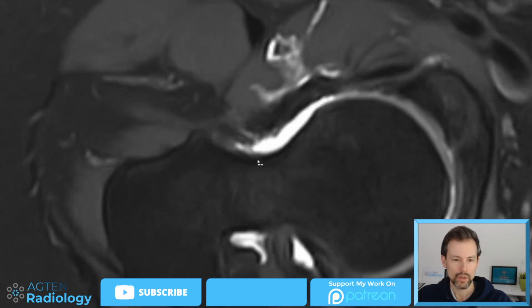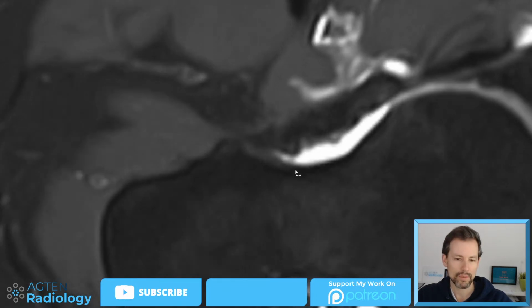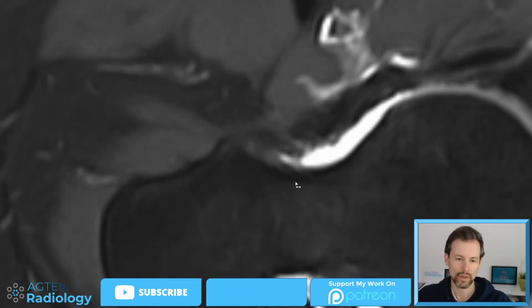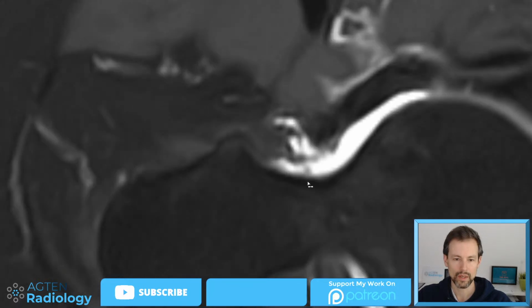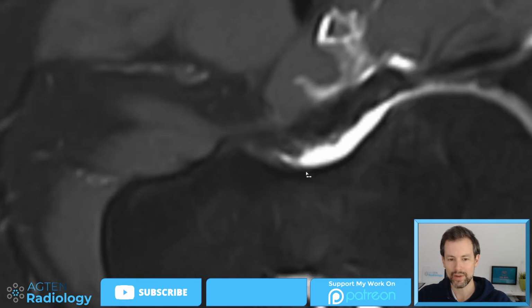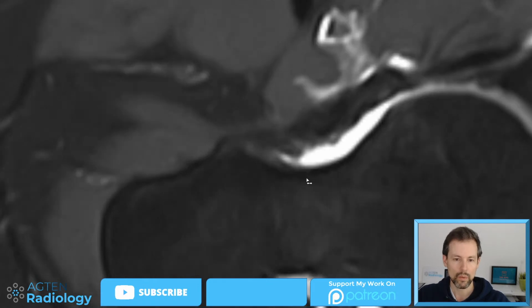Yeah, anyways. So if you look closely, you can see there are some very small adhesions there. So this one, for example. And sail-shaped, it's quite a descriptive term, so I think we cannot really appreciate this from the MR images alone, but it's not a complete adhesion because we still have contrast here. So it's just coming down here. You can also see some very, very subtle adhesion, a tiny thread here. Whether these are clinically relevant, it's questionable, probably not, because you see adhesions in the postoperative setting quite a lot.